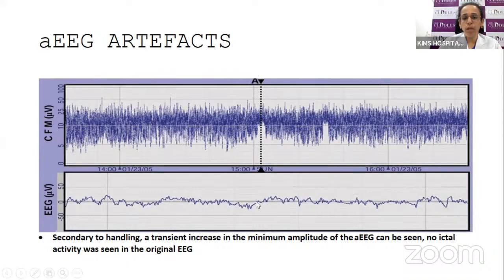So that's why comparing both and noting down the caregiving procedures and baby movements is very important to interpret the EEG and to avoid misinterpreting this as a seizure activity. So this is one of the commonly missed things, the artifacts which should be kept in mind whenever we are interpreting an EEG. So take the help of the neurologist also. Like once you have done your interpretation from your side, please take their opinion also, and then counsel about the prognosis and the other parameters to the parents.